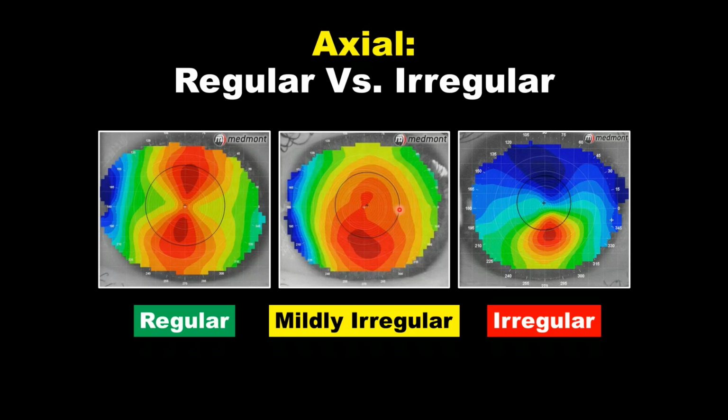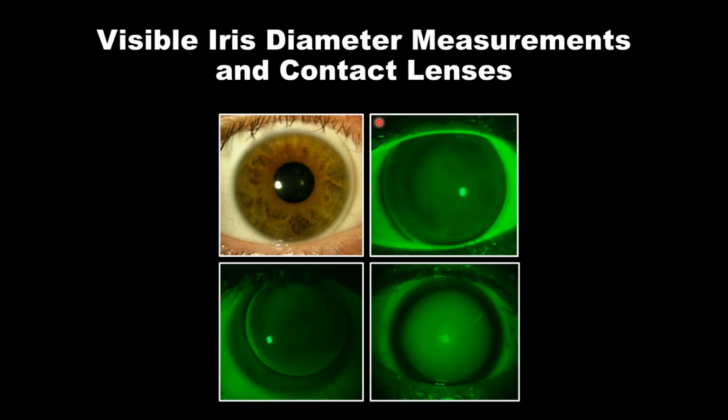This patient is indicating to have some irregularity to the eye shape, the inferior hemisphere not exactly a mirror of the superior. This patient may not achieve perfect quality of vision. This patient, of course, is going to have a very low best corrected visual acuity. So to understand that, you want to use the axial map, axial for vision.